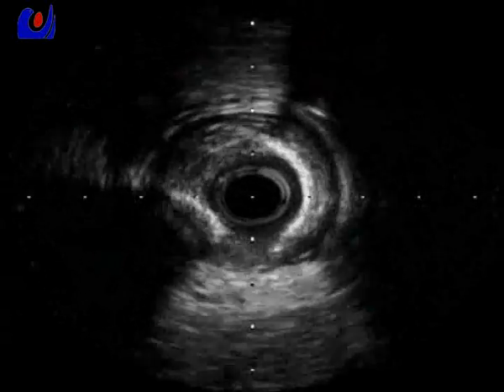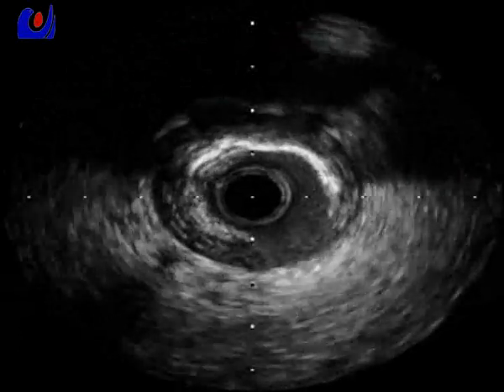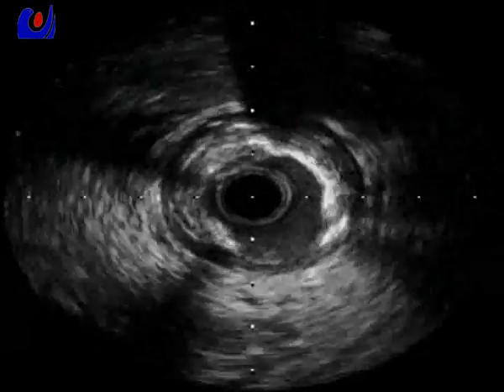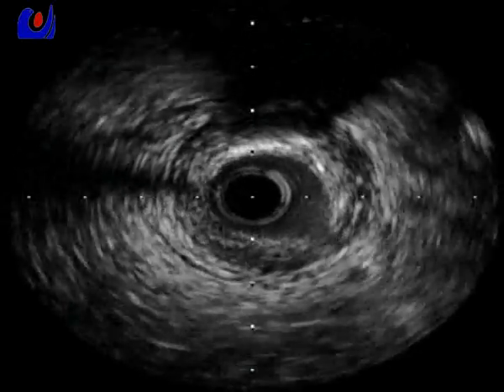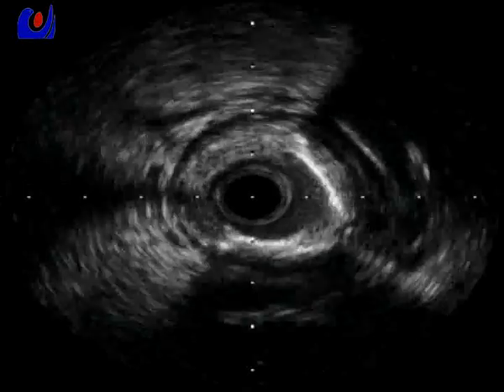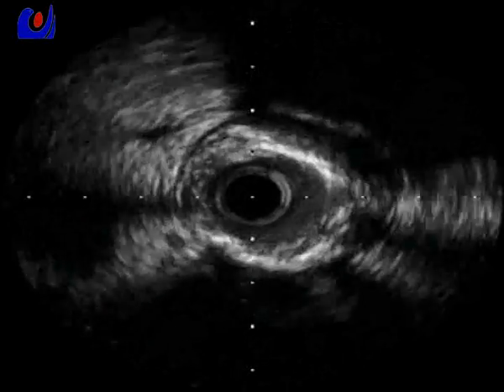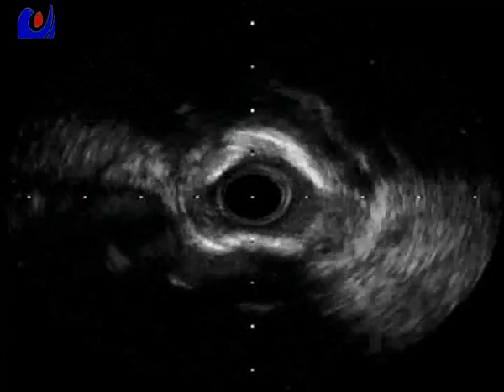In the proximal, near the orifice, the orifice also has another calcification, so we have to see. So the proximal does not have that much disease, but has ostial stenosis and is also calcified.